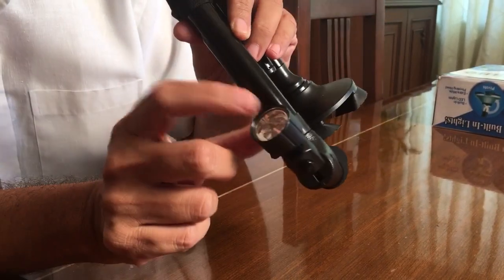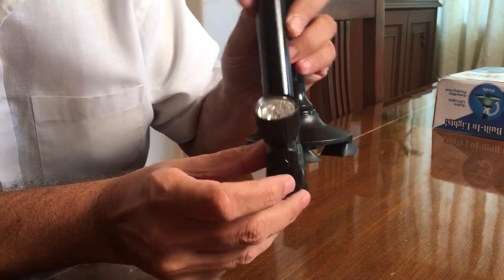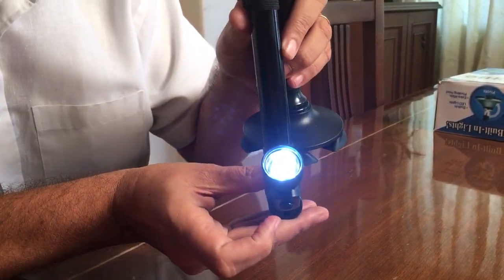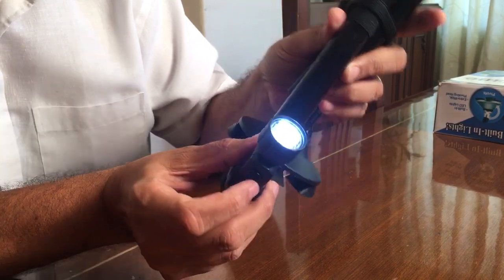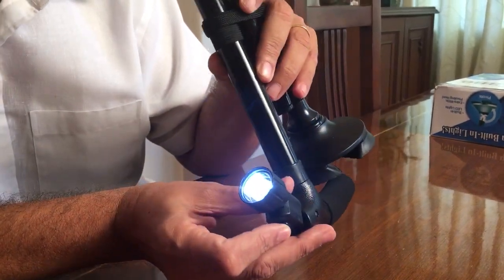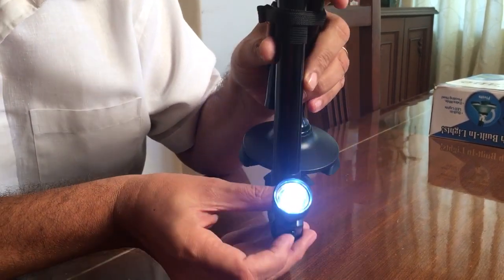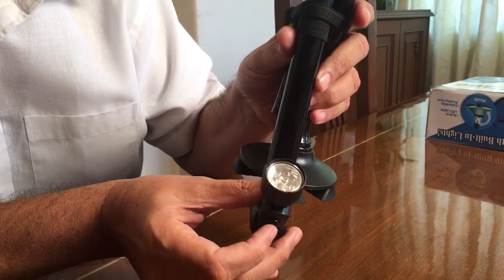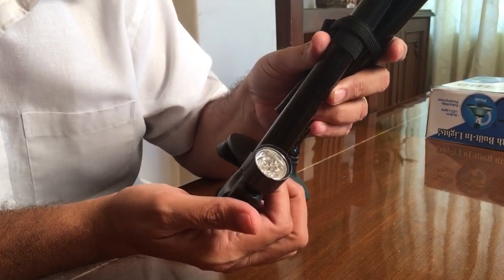A very unique feature is this flashlight. All you do is press the button and the flashlight, which has six LEDs, comes on. When you don't want it, you can just shut off the flashlight.